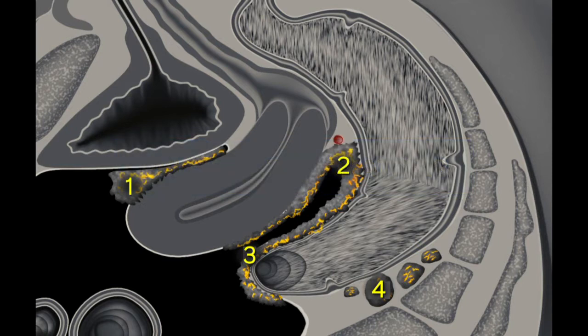This video presents peritoneal spread in the pelvis. We will first look at the anterior compartment, where visceral carcinomatosis is located in the vesico-uterine pouch and on the surface of the bladder, followed by parietal carcinomatosis in the pouch of Douglas, visceral carcinomatosis on the bowel, and mesenterial carcinomatosis.